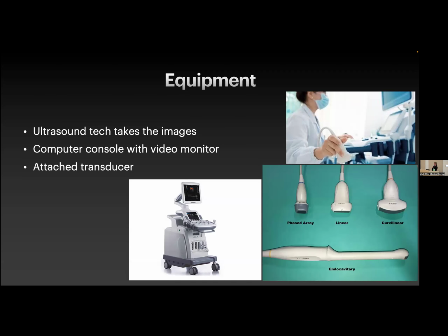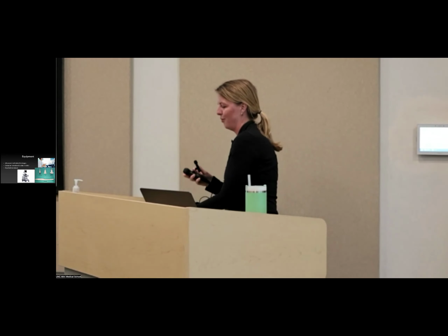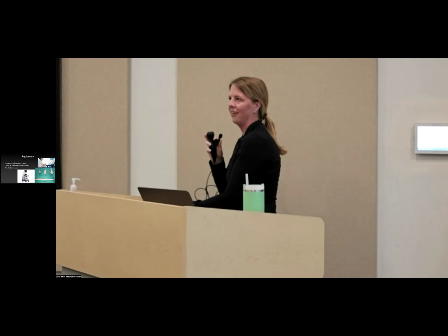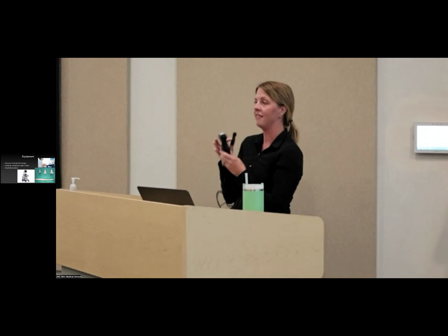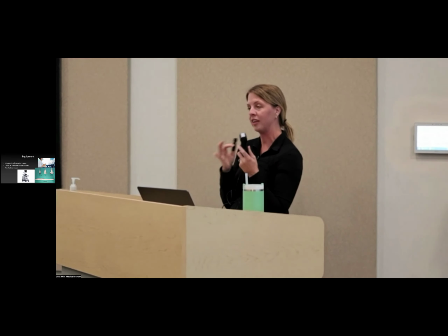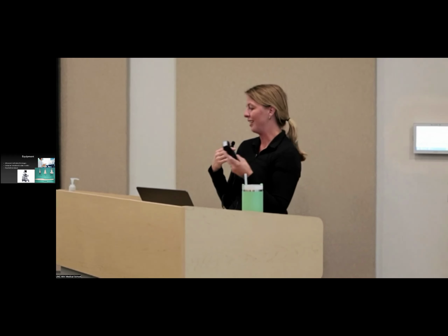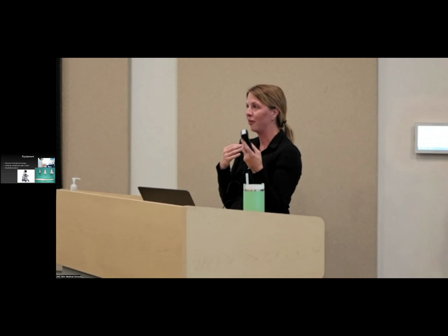And then finally, we have transducers. I show you this one because this is a butterfly probe. This is something handheld I can take with me. As you see, we have it hooked up to an iPad. You can hook it up to an iPhone. It's really wonderful, especially for places that maybe are resource limited, right? We have a global radiology program at UNC, particularly in Malawi. And in Malawi, they don't have an MRI magnet. So what can you do? You can take a butterfly probe and provide diagnostic medical imaging for a location or for individuals who might not have access to some of the other modalities that we have.